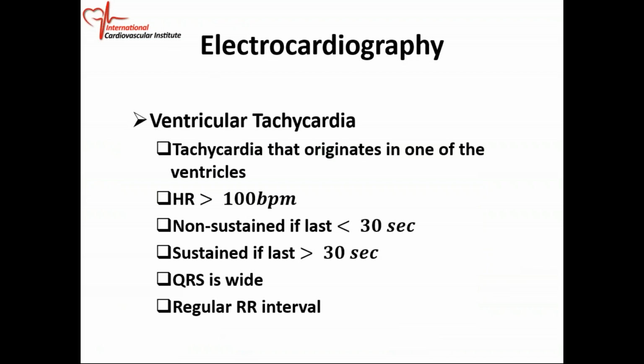All right, so we talked about atrial flutter and atrial fibrillation. Let's go to ventricular tachycardia in a little more detail. So again, as we said, the classic definition for ventricular tachycardia is 3 or more PVCs in a row. The rate is usually greater than 100 beats per minute. And of course, this arrhythmia originates in the ventricle. That is why it's called ventricular tachycardia.